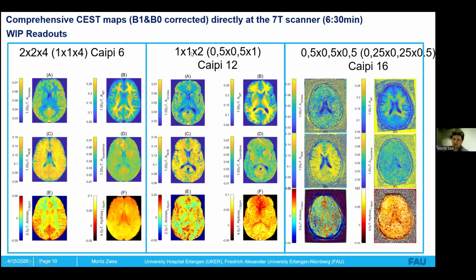So here's another benefit of this hybrid approach, or you see how far you can go. You can really use all this deep learning that we just learned about in radiology, where normally it is used to speed up all the scans. We use it here for resolution.